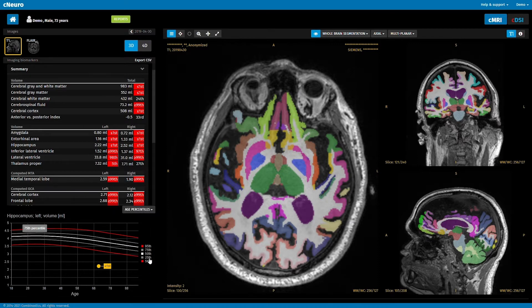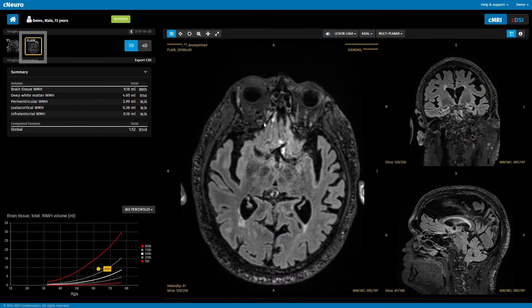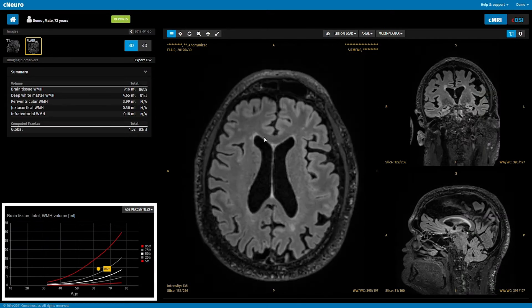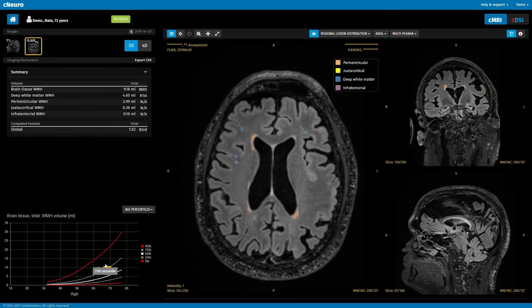If the patient has FLAIR images, then CMRI segments white matter hyperintensities, again with comparison to normative reference data. Results are summarized in reports that are sent to your PACS.